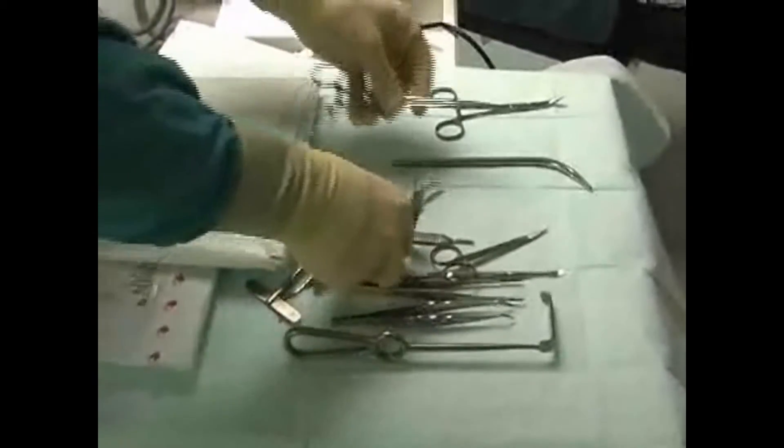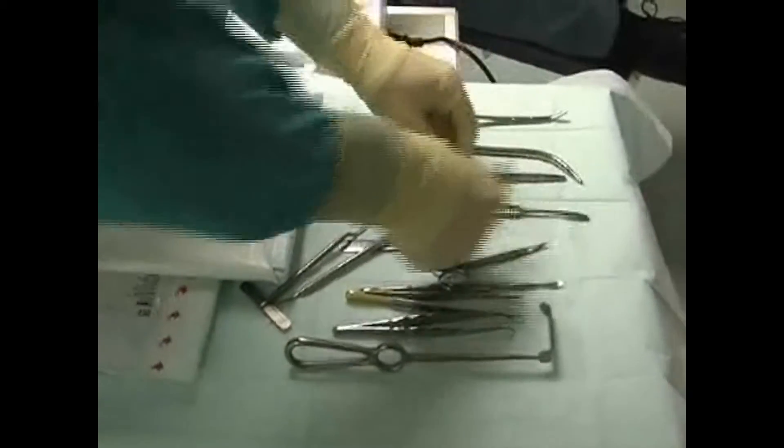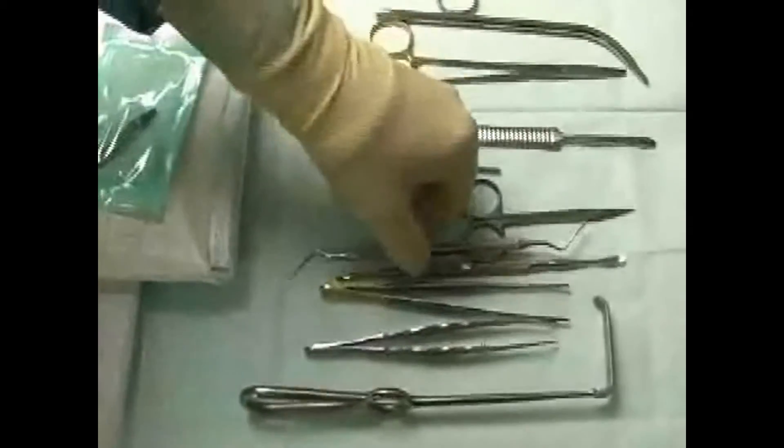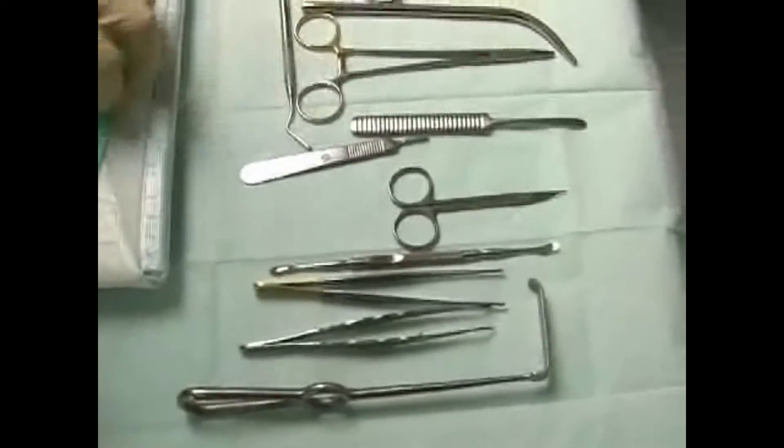Prior to surgery, the container is opened and the surgical instruments can be removed using sterile gloves. The sterility chain remains intact. The usage of surgical containers is standard in hospitals, but not in doctors' offices.